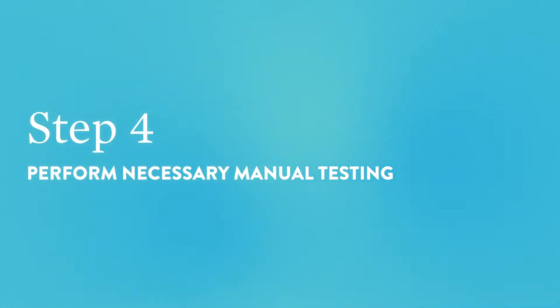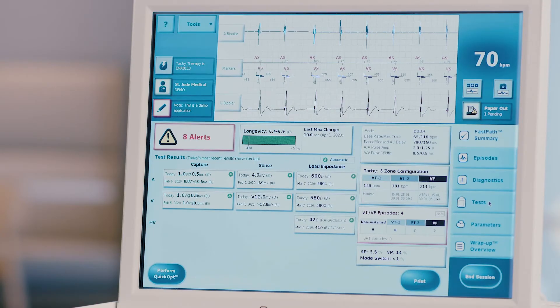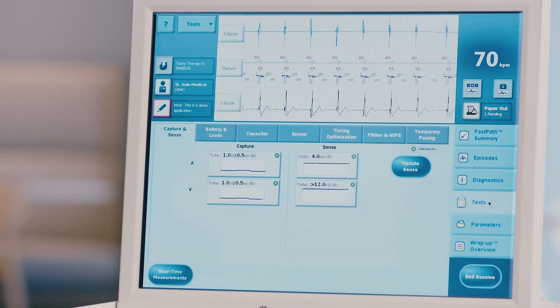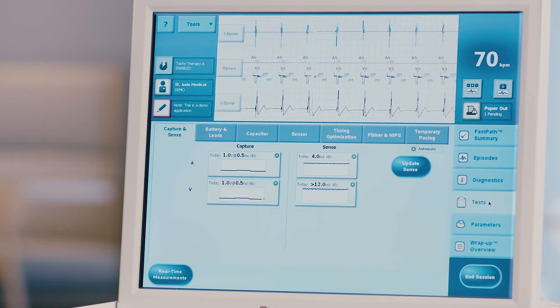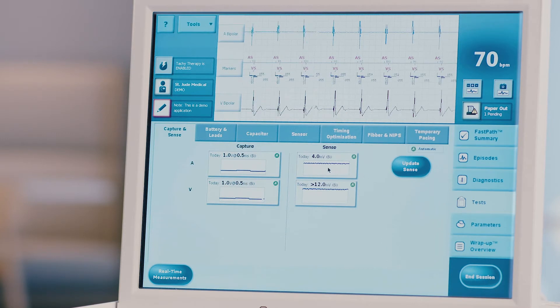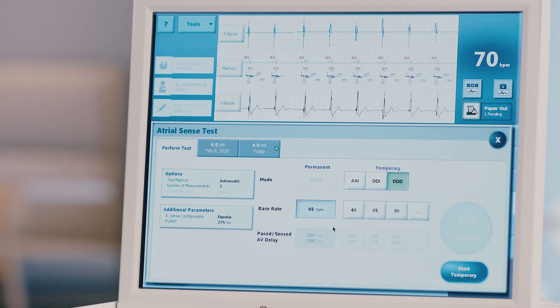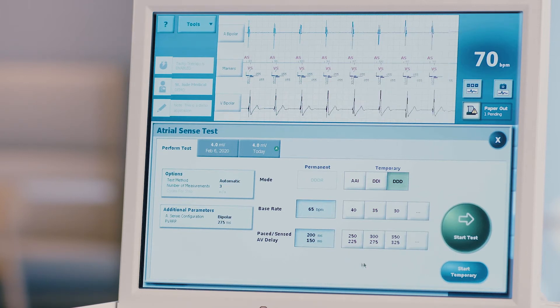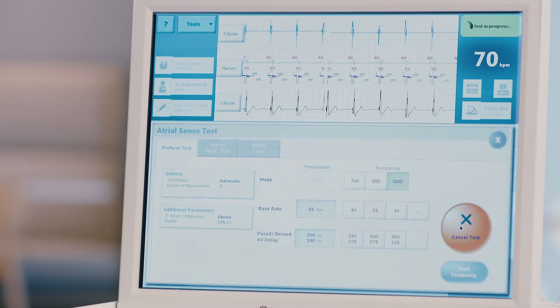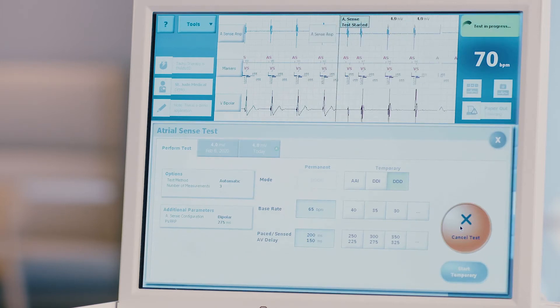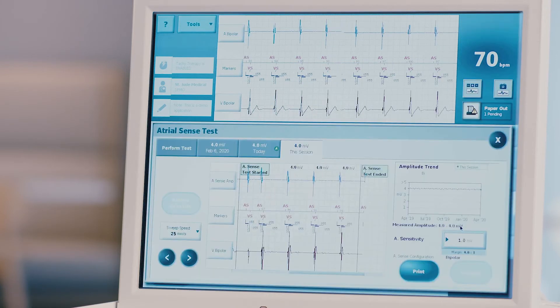Step 4: Perform necessary manual testing. Do this only in the presence of a healthcare provider or certified Abbott employee. Press the test tab on the right side of the screen. The capture and sense tab will open first. Complete any necessary tests that have not been automatically performed. Press any box noted as 'not performed' to open the manual testing screen. Make the appropriate settings adjustments per the recommendation of the healthcare provider or certified Abbott employee. Press the start test button or hold the button as directed for manual threshold testing. For automatic testing, the test will end once the data point is collected. For manual testing, the test will end once you visually obtain the measurement and release the button. You can cancel a test at any time by pressing the yellow cancel test button. No data will be recorded.